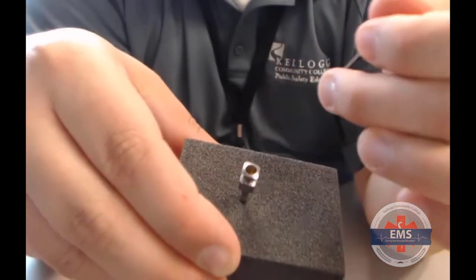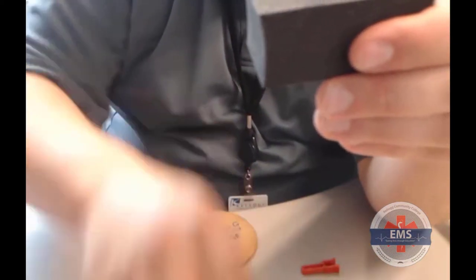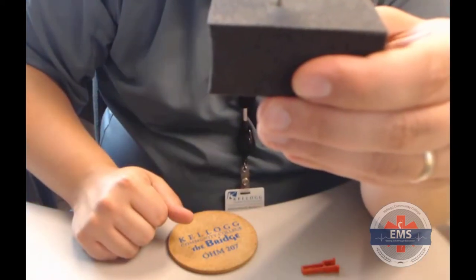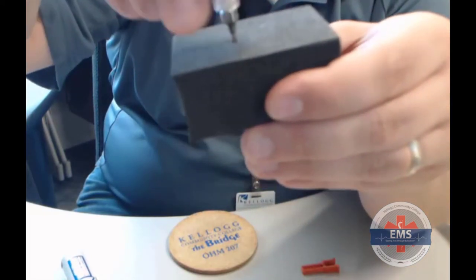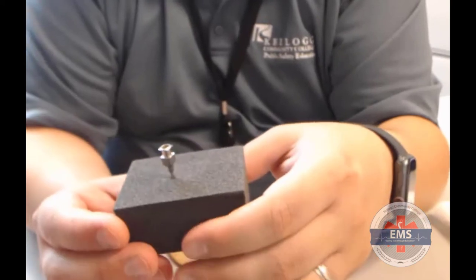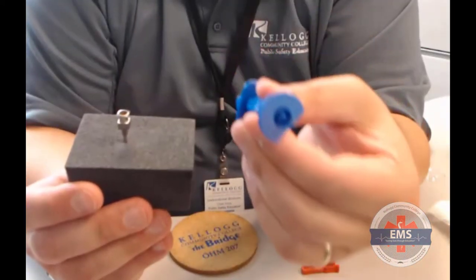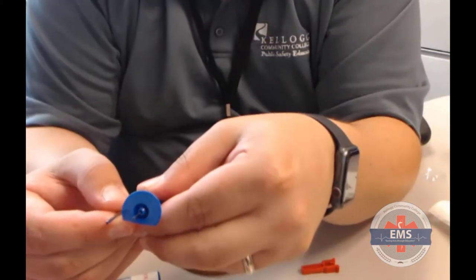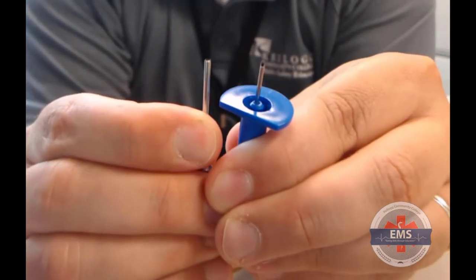Okay. Now I can hook up my Luer lock, or I can hook up my stopcock again. Any of these tools would be effective as far as gaining access. Again, this is the adult, your 15 gauge. 18 gauge is for your peds. They're not as reliable as the Easy IO or some other type of drill-like IO, but they are a good alternative to a Jamshidi, because you can just see the size. Obviously, this is meant for an adult. This is meant for a ped, but the stability there, if you look at the two needles, you can get a good idea that this guy here is definitely a little bit more rigid.